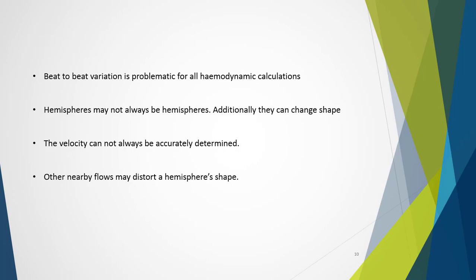Beat-to-beat variation, as seen in previous calculations, can lead to error. Thus, it is important that numerous measurements are taken. Even in sinus rhythm, a sonographer who averages 3 to 5 measurements will deliver a much more desirable result. In the presence of atrial fibrillation, bigeminy, or frequent ectopic beats, then 8 measurements will deliver improved accuracy.